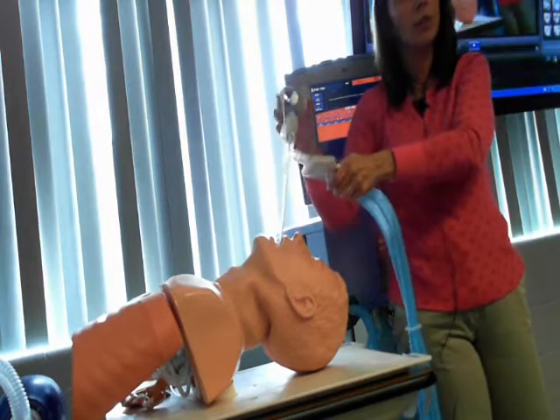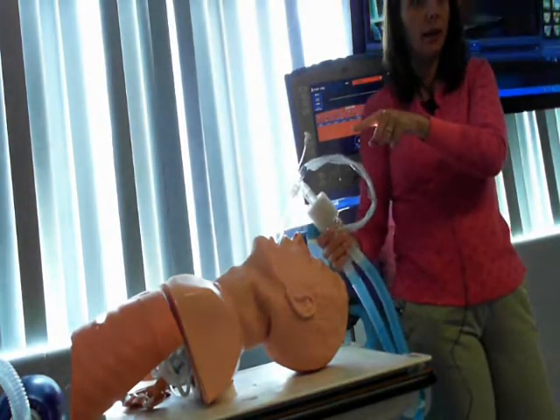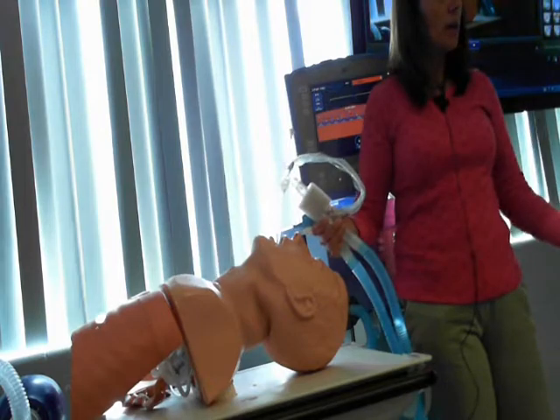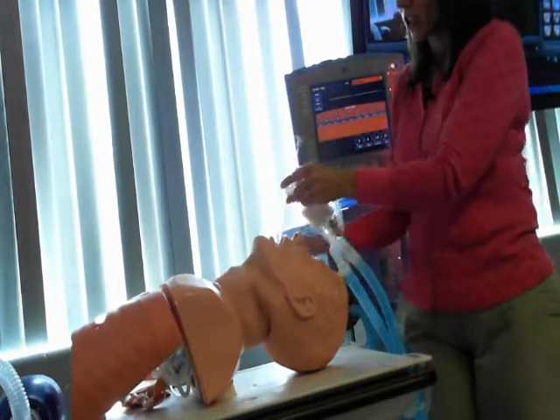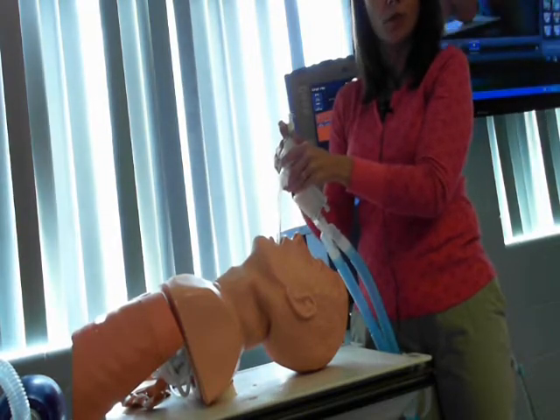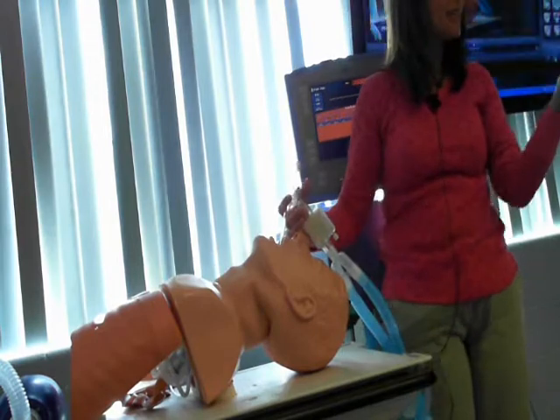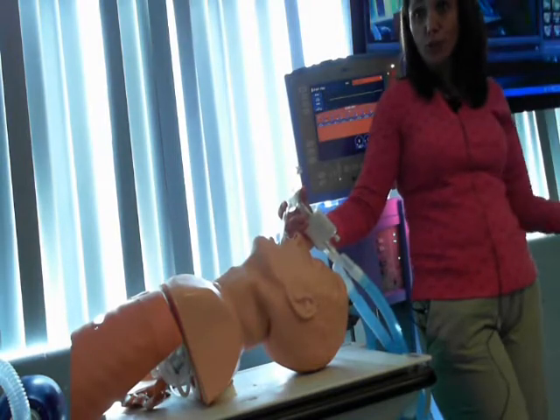Because here's what this tells me really quick, okay? There are multiple things that could cause a problem with this airway, that could cause the high peak pressure alarm. My tube could have slipped, their compliance could have changed, they could have mucus building up, they could be biting their tube, okay? That's just a few of the things. When I drop a suction catheter, guess what I'm learning? Okay, I've got a patent tube, so they're not biting it. I apply suction and I come out and I see, do I have secretions and are they thick? In one big movement, I take away two of the most common causes. So that's why I encourage people to do that.